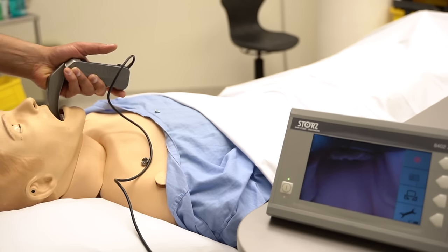Sometimes my blade might be too far in — that happens often when you first start out. All I have to do is slowly trace back until I can see the vallecula and the cords. To demonstrate tube insertion: if I insert it this way it blocks my view completely, but if I insert it to the side it can really help my view. I hope you enjoyed those tips — good luck with your next intubation.